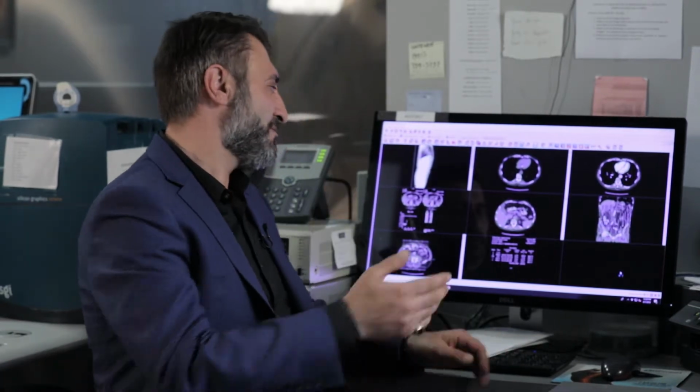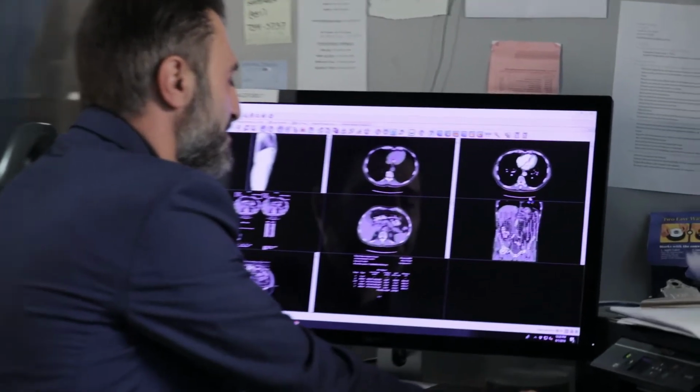And you will hear that the study is done sometimes with that chalk fluid, which is called barium, or it's done with an IV injection, or both together. The oral part you drink is for the digestive organs: the stomach, the colon, the intestines and all that. And the IV injection is used to determine any vascular issues, or if you're suspecting cancer, a mass, and all that stuff. So let's come on over here and take a look at some images.